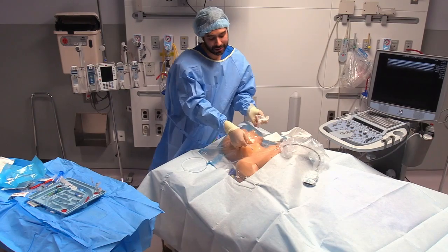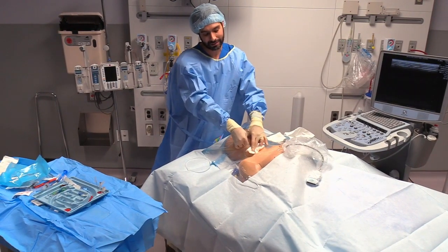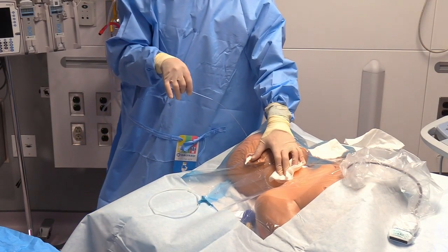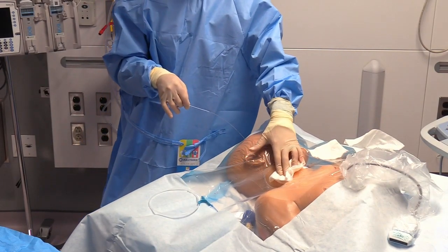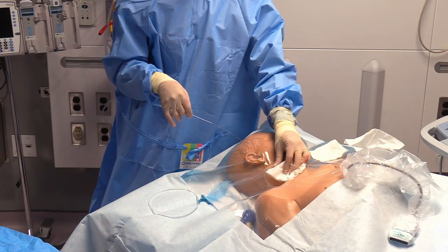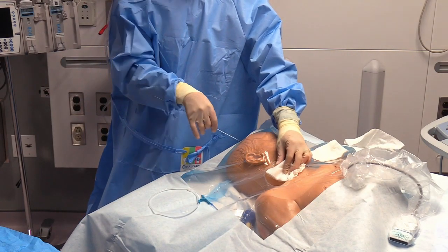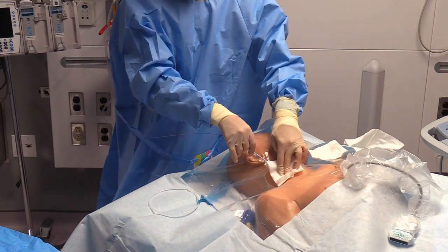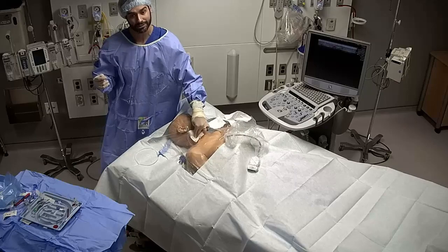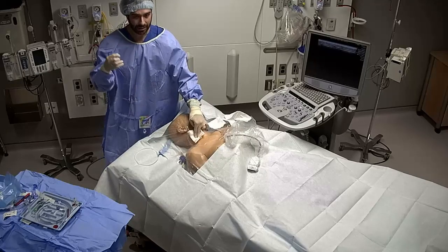Once I've done that, I'm going to take my dilator and pull it out. I'm going to hold pressure there. People often say here, you're not holding the wire. Now, if you're practicing or you're a novice, you definitely want to hold the wire, or have somebody else hold the wire. But the wire is not going to get sucked into the patient unless you push it in. So when this comes out, I will hold a little bit of pressure on the wire and just take the dilator off. This is holding pressure where I just dilated, in case I dilated the anterior wall of the vessel itself.